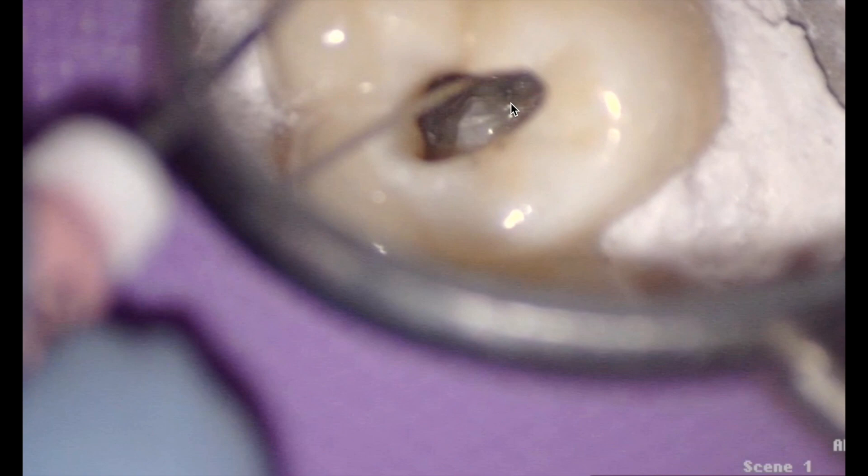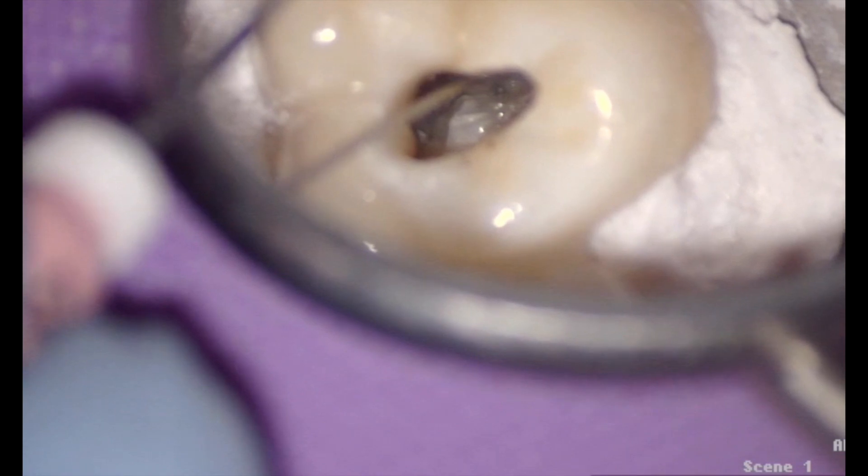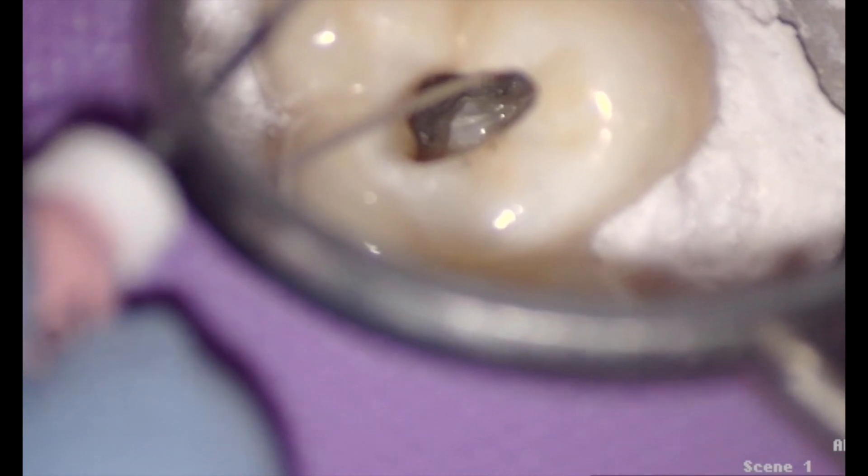There's no rules to endo other than: get rid of the vital tissue, get rid of the bacteria, and get some great outcomes — other than that, you can do essentially whatever pattern progression you want. Then I came back and tackled the two remaining canals. By that time it had cleaned out and I could see what was going on. This is another tip from John Cadamy — he has a Dental Town group, something like calcified tips to calcified canals.